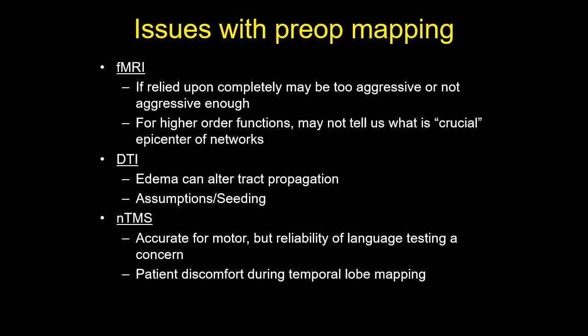For diffusion tensor imaging, it's important to consider that these are mathematical constructs subject to assumptions in seeding paradigms, and also that edema near the tumor can alter tract propagation, leading to false negatives.